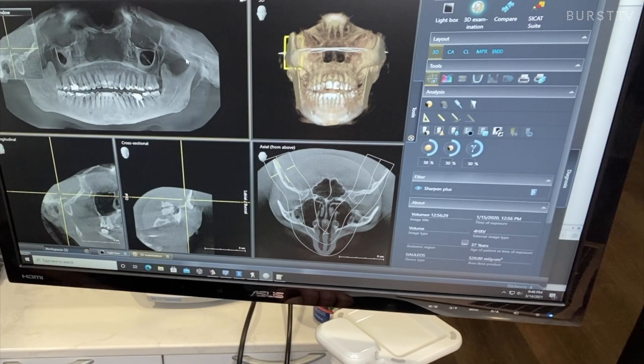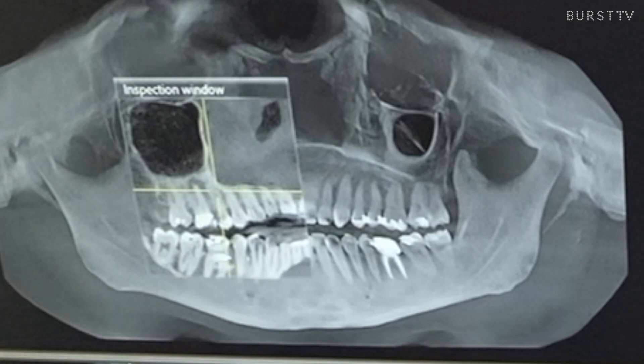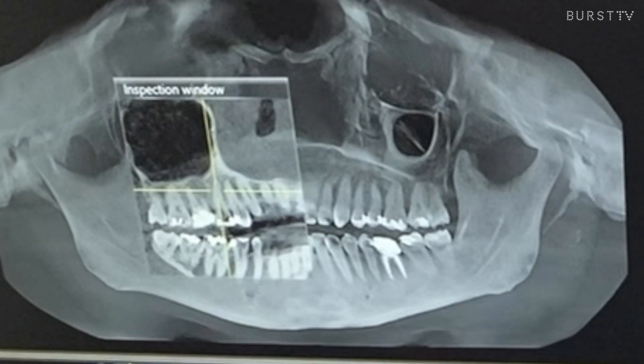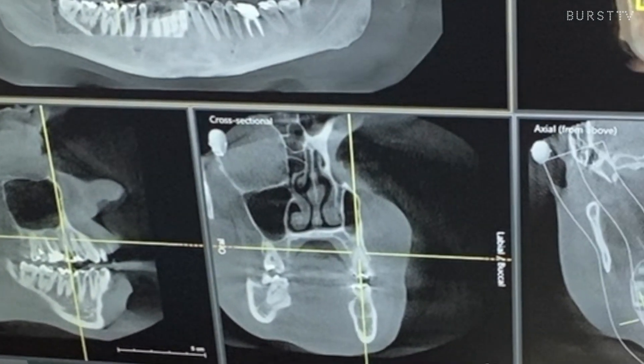The reason I really chose this case: this patient came in and I just took a routine PA because she had a root canal and I wanted to check on it. She had had symptoms prior, they went away, and we wanted to make sure and see how the patient was doing. When I took that x-ray, it looked a tiny bit dark — it doesn't really look like much, I didn't think much of it. But if you go look at the scan we took and hover over that area, you can zoom in and scroll in and see what a large amount of bone is missing from that area — what a huge abscess that is. The cone beam can zone in on a single tooth root and allows us to section through to see the bone easily.